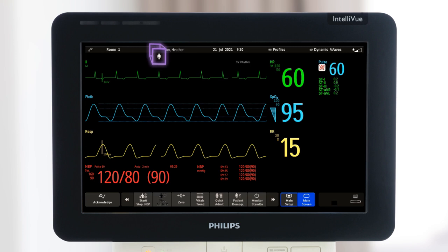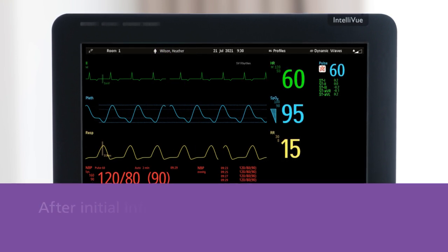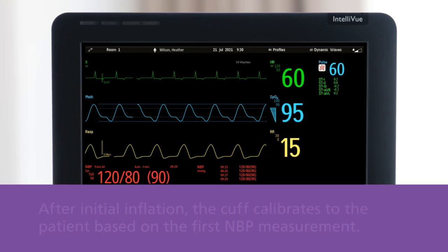Initial cuff inflation is dependent on the patient category selected in the monitor. After the initial inflation, the cuff calibrates to the patient based on the first NBP measurement.